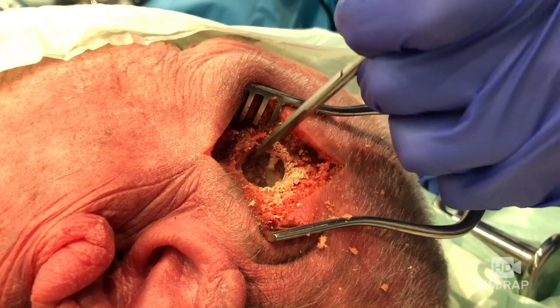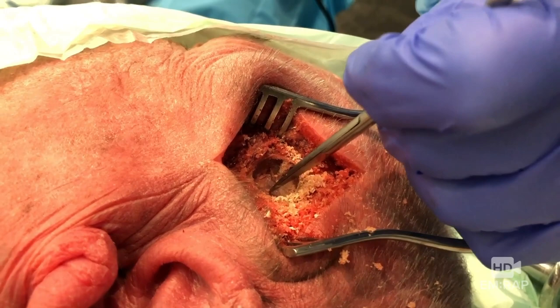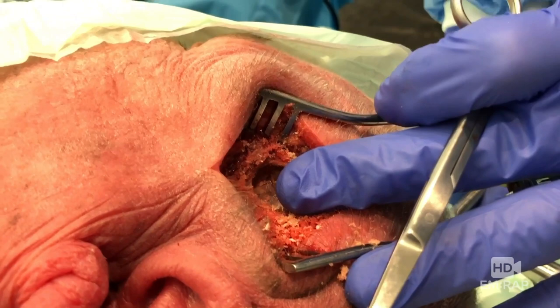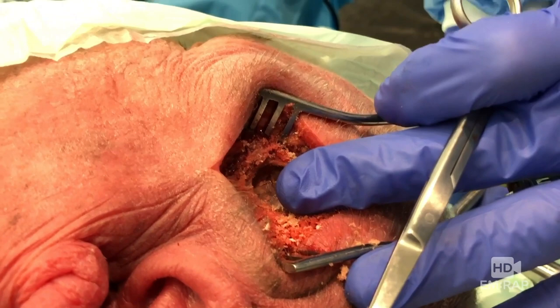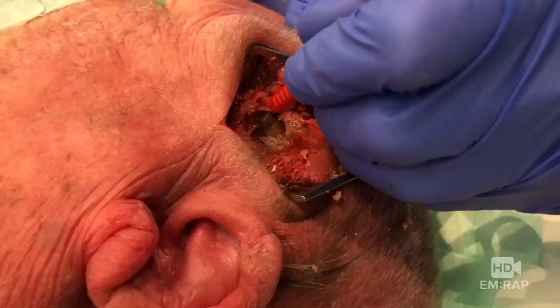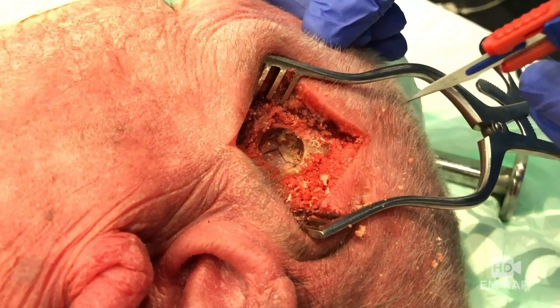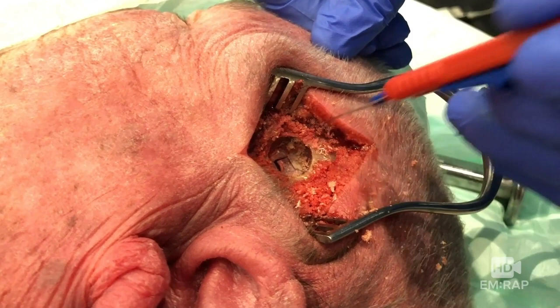This soft layer that you see here — that's the dura. So if there was an epidural hematoma, it could be evacuated at this point, and you can use irrigation and suction to remove the clot. If you're attempting this procedure for a subdural hematoma, we need to go one step further. Alternatively, if you thought it was an epidural but you don't see blood at this point, we need to open up the dura. Use the scalpel to make a three-sided incision — a window in the dura — or this can be done with an X-shaped incision. With the subdural hemorrhage exposed, you can irrigate and you can blot, but do not suction because you might rip some of those little bridging veins and worsen the bleeding.